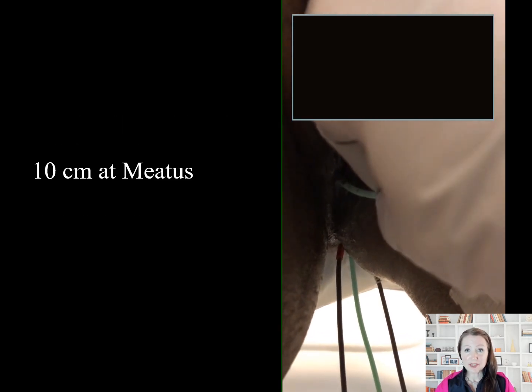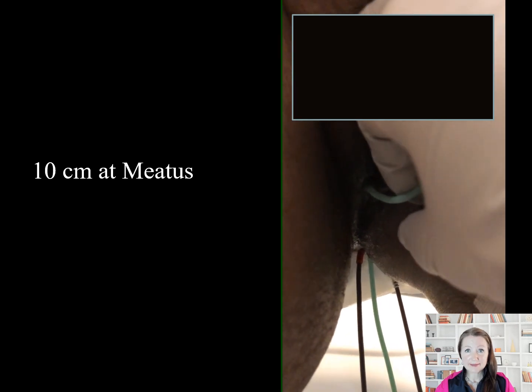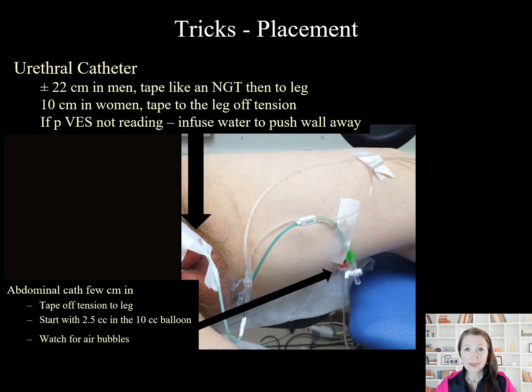The 10 centimeter mark should be at the meatus in females. In men, the meatus will be approximately at the 22 centimeter mark and should be adjusted according to the length of the urethra. The rectal catheter should be 2 to 3 centimeters beyond the sphincter with 2.5 centimeters in the balloon. All air must be evacuated and replaced with fluid. If the rectum is closed or must otherwise be avoided, the vagina or an abdominal stoma can serve as an alternative.